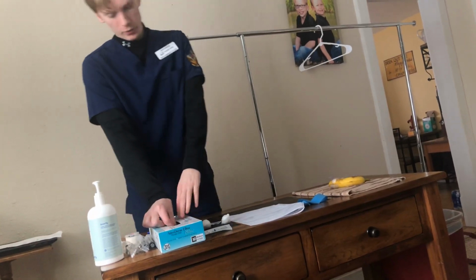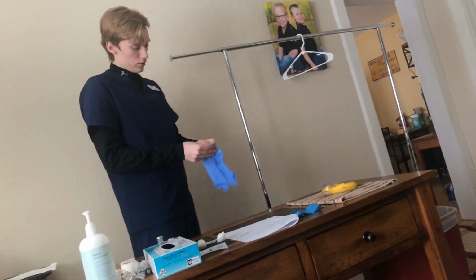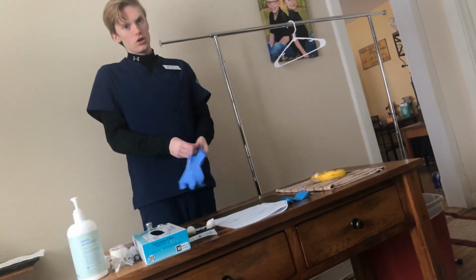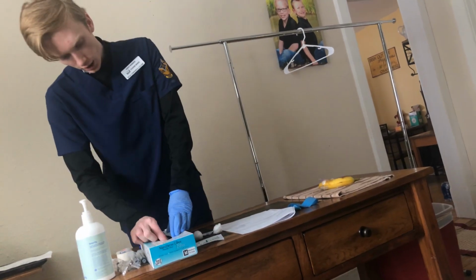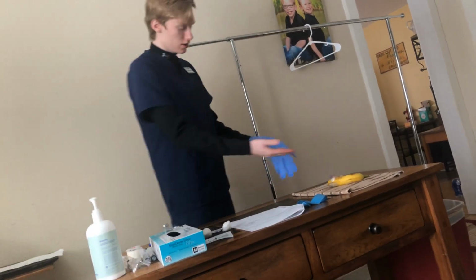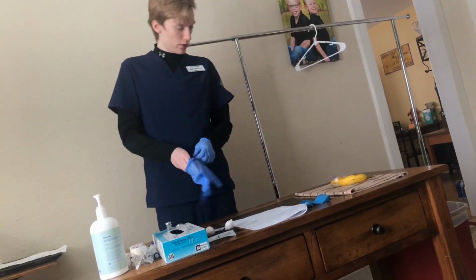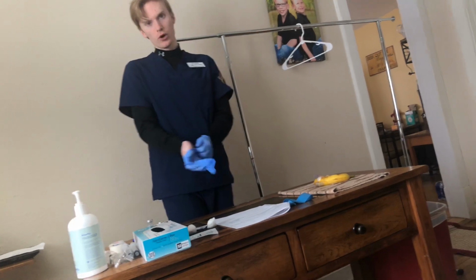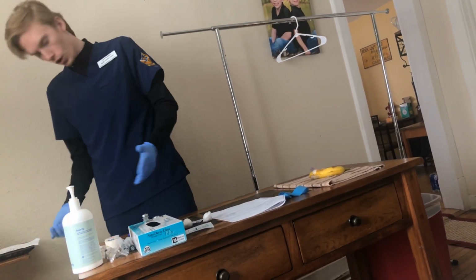So now that that's done, we are good to DC the IV cath. So I'm going to don some gloves, introduce myself to the patient. Hello, my name is Nurse Downing again. How are you doing? Good. How is the pain? Wonderful. I am here to DC the IV cath, and we'll get you on your way. So now that we have introduced ourselves, can I get your full name and date of birth? Perfect. We need the identifiers. We're good to continue with our order.